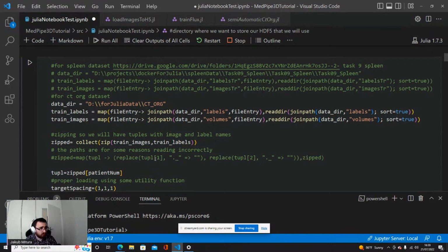Yes, this is not to get the best results. If you would not get very good results, this is quite probable, because it will be variable between person to person, between data to data, between patient to patient. In this particular implementation, do not be afraid of it. Yes, you can have very bad results, and maybe I would have also, because this is quite random to some extent, at least.